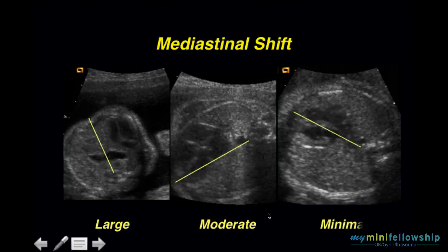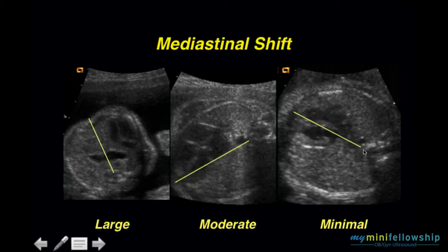In this case, we draw our mid-sagittal plane and can appreciate that the entirety of the right ventricle is in the left hemithorax — a minimal mediastinal shift. This type of mediastinal shift can't be recognized unless you consistently draw the mid-sagittal plane. You don't have to actually draw the line, just mentally draw it to see the position of the cardiac chambers relative to the mid-sagittal plane.